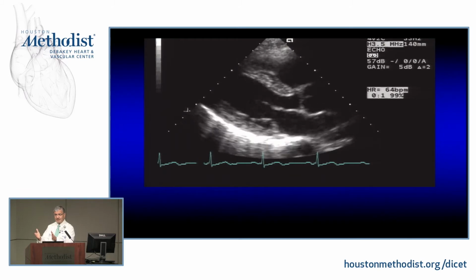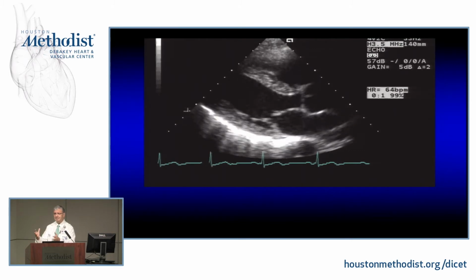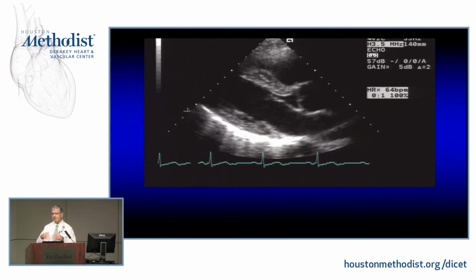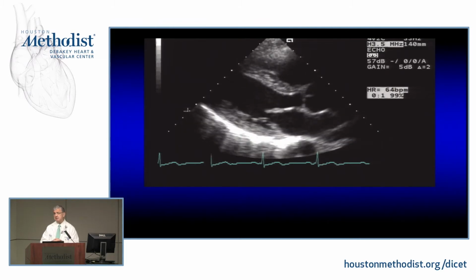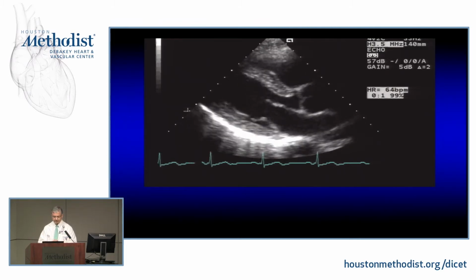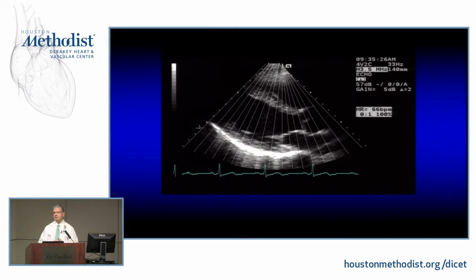I'd like to do it fast enough so I can look at this heart, since it's moving, almost in real time. And with parallel processing and so many other things, your frame rate, how often I can update this, can be in the 60, can be in the 100 range, so it's pretty close to real time.